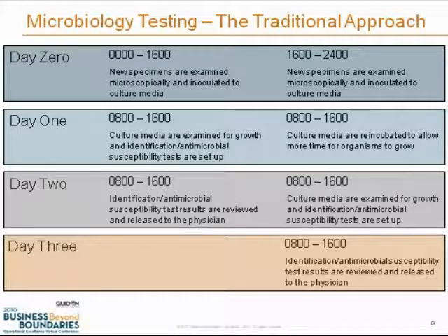Now, one has to realize that when cultures are inoculated, the microorganisms that may be present in the specimen begin growing immediately. However, for us in the laboratory to have enough culture material to work with, that is, isolate from the specimen, enough time has to pass in the incubator for the organisms to form visible colonies.